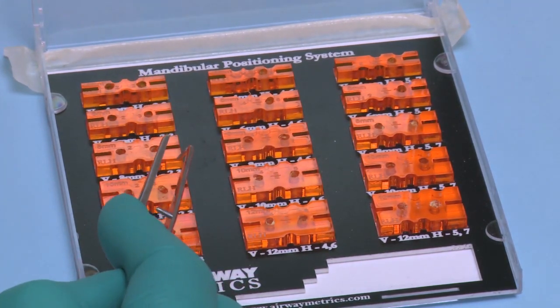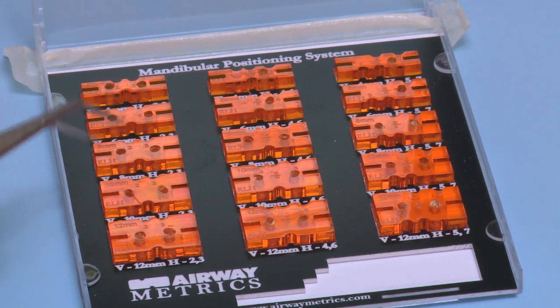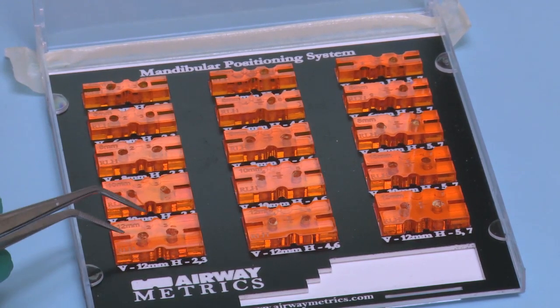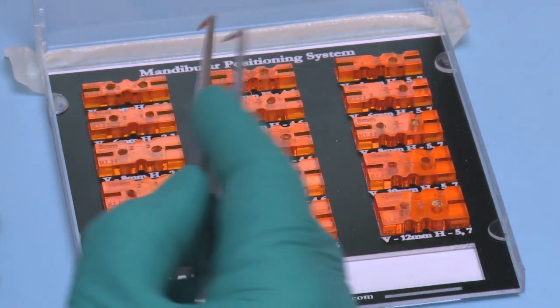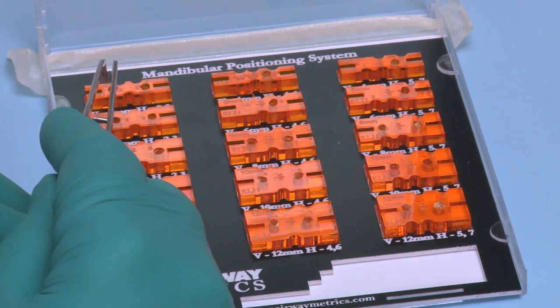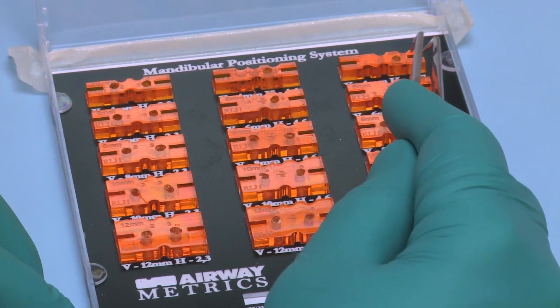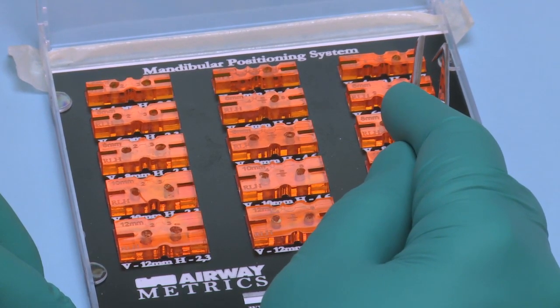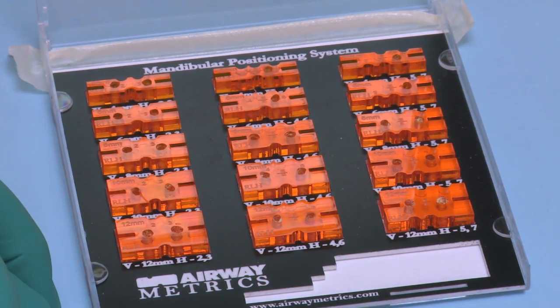Each one of the keys is set up appropriately at either 4 millimeters of vertical, 6 millimeters of vertical, 8 millimeters of vertical, 10 millimeters of vertical, or 12 millimeters of vertical. Then if you go horizontally, it goes from 2 millimeters of horizontal movement or protrusive all the way up to 7 millimeters of horizontal movement or protrusive. So we saw that Kim responded very well at 4 millimeters. Remember that the minimum thickness that you need for an oral appliance is 4 millimeters.